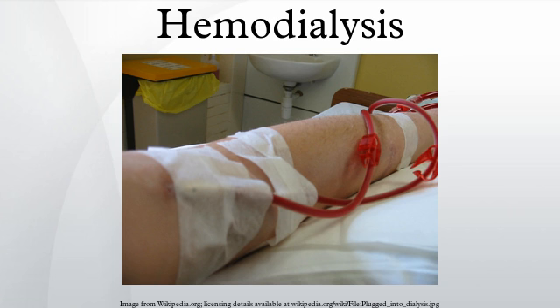Even this degree of water purification may be insufficient. The trend lately is to pass this final purified water through a dialyzer membrane. This provides another layer of protection by removing impurities, especially those of bacterial origin, that may have accumulated in the water after its passage through the original water purification system.